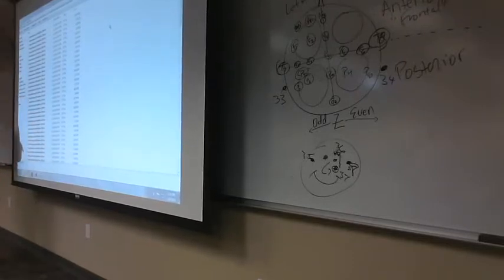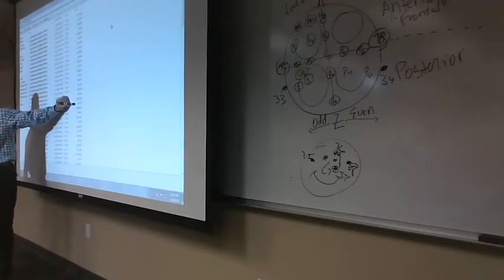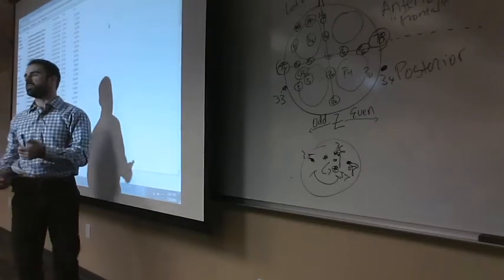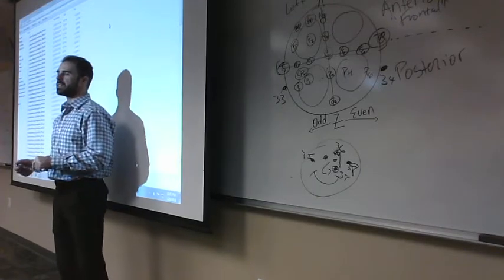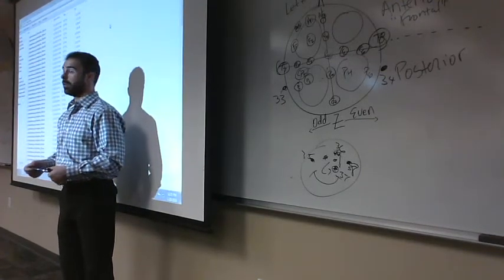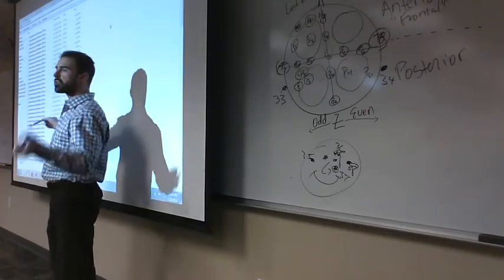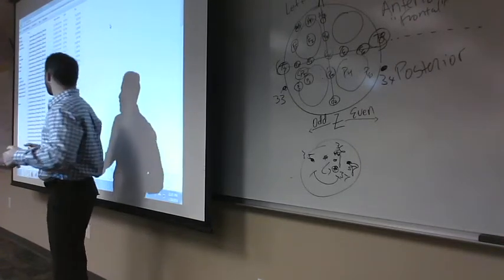Make sense? Okay. So our small file is basically what we might call a header file. That is a file which contains the names and some of the basic file information about the file, but not the real data. The real data is in the large one, the FDT. So that's some information about understanding our structural organization here.